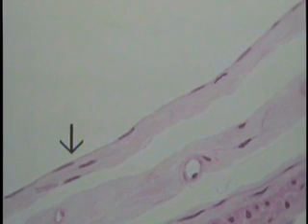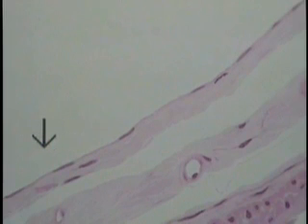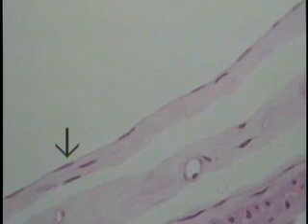this is a fairly decent section through the mesothelium. Remember, an epithelium is a covering or lining type of epithelium, so you want to look on the external surface of various organs and other structures. So this is the mesothelial lining, a form of simple squamous epithelium.